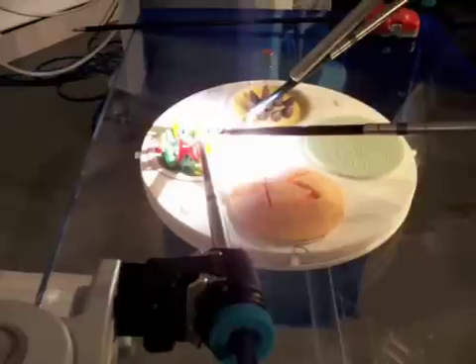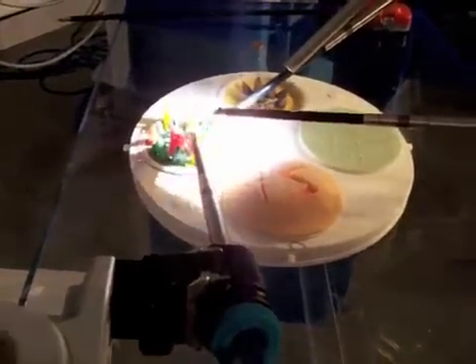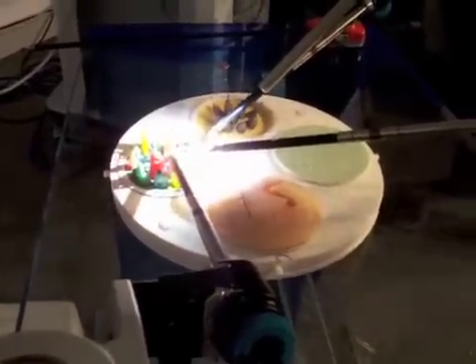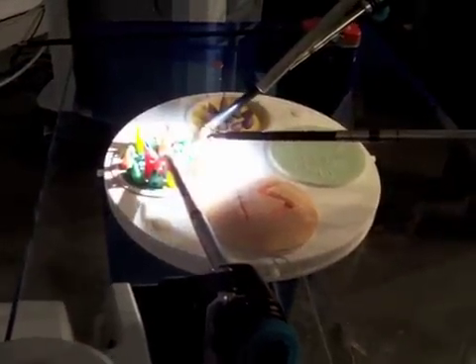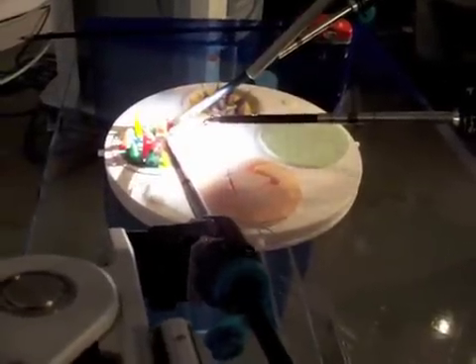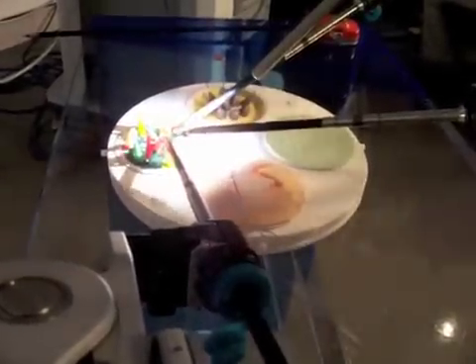And you can move them wherever you want in the field. So on sterilization — this system actually has drapes that go on during surgery.